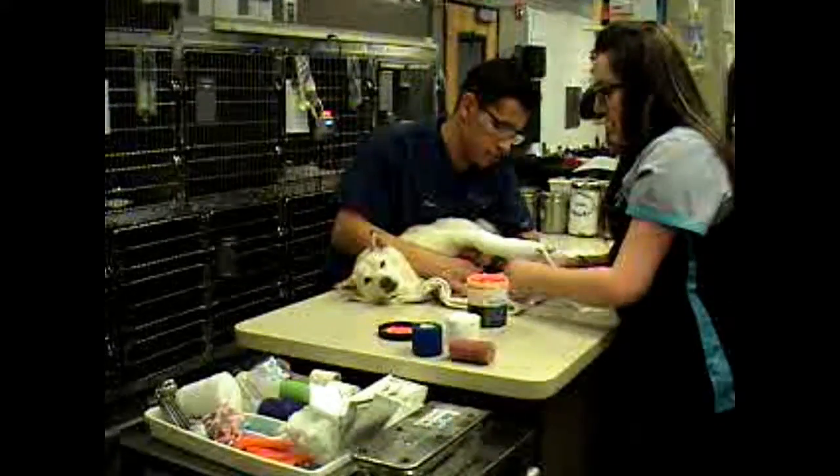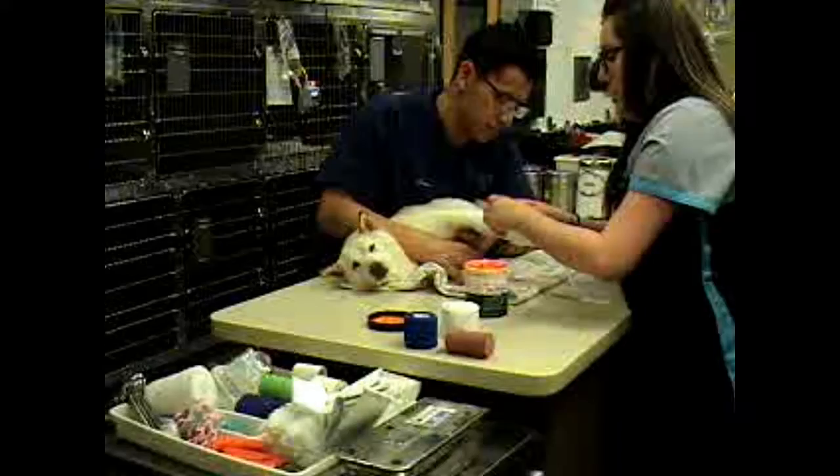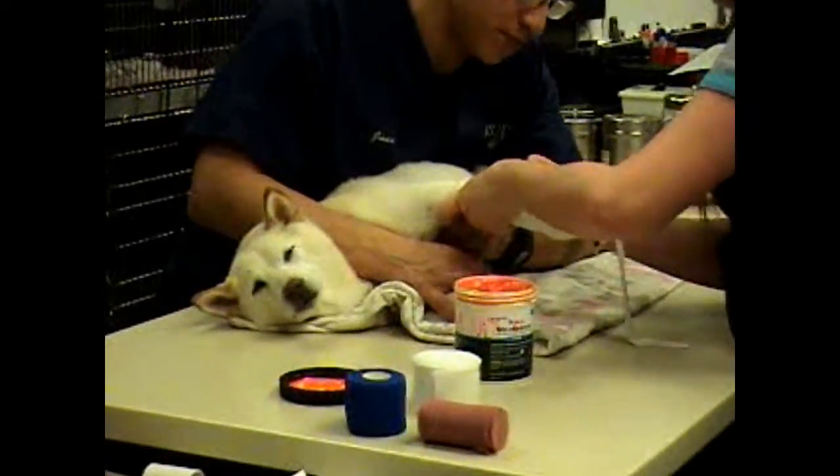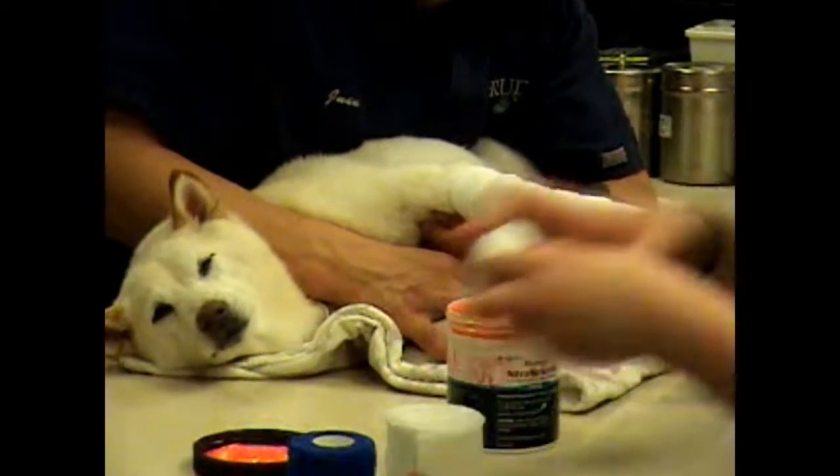We're just going to lightly wrap this around the limb — we don't want it to be too tight to cut off circulation. We're just going to use about half of that.